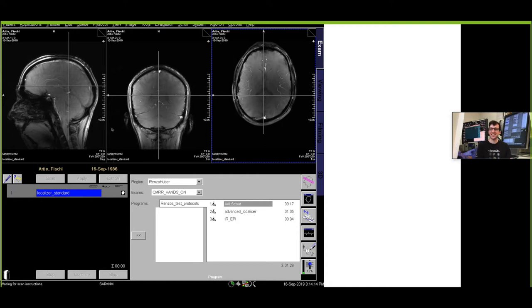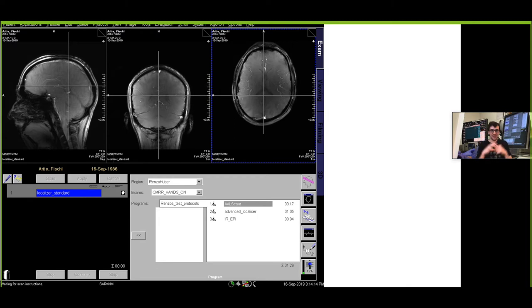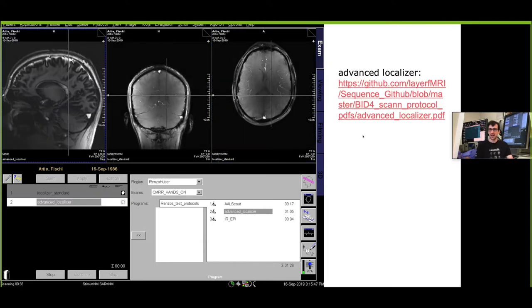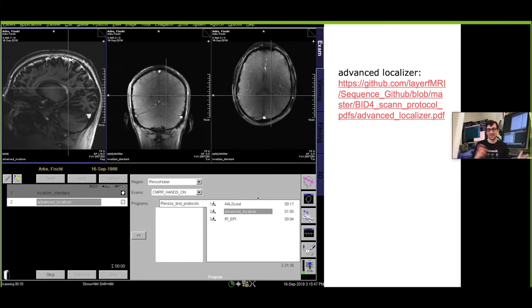In layer dependent fMRI we have small slabs in order to get the TR down, so for layer dependent fMRI we need more structure. For that there are these kind of inversion recovery turbo flash sequences that you can form into a localizer. If you want a protocol you can download it from there which gives you a nice gray matter white matter contrast.